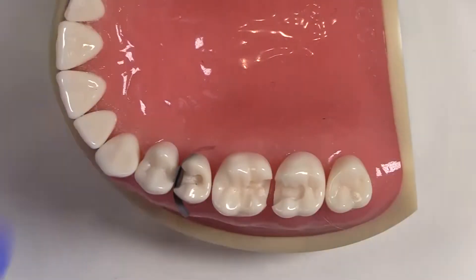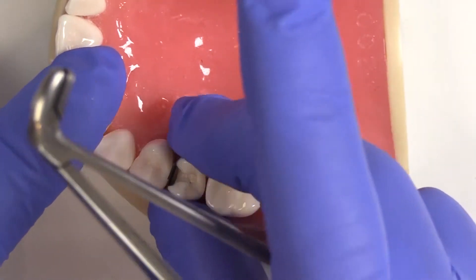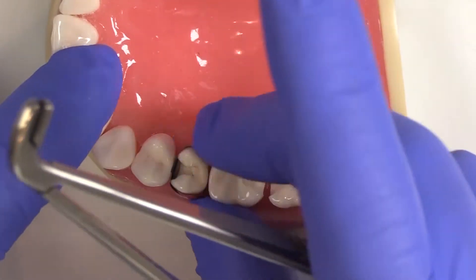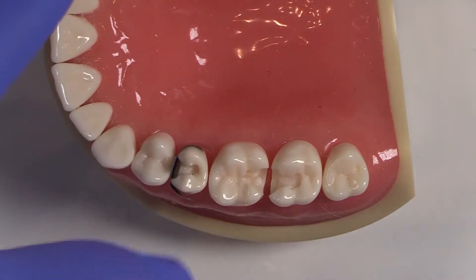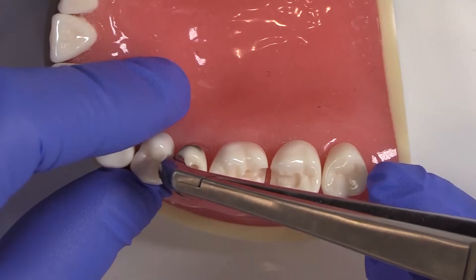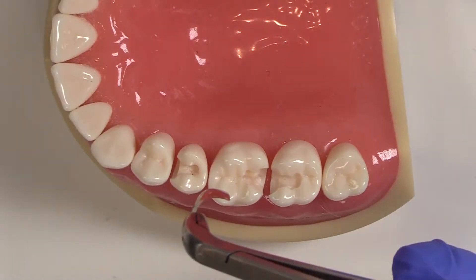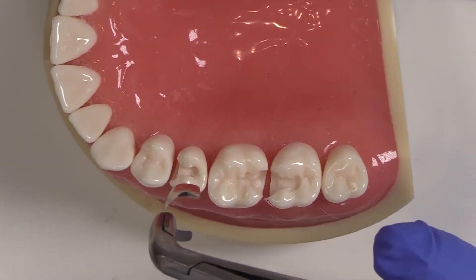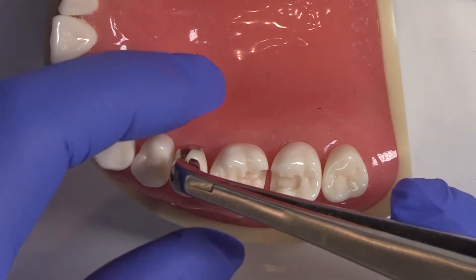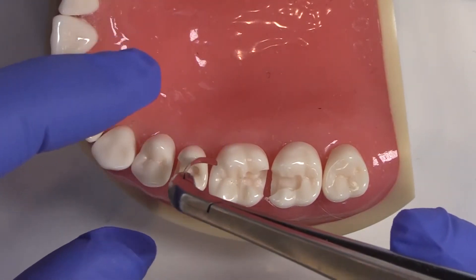What I like to do before I place it in is either pre-bend it or place it on the tooth and give it a little bit of contour to begin with. Then as I come in to place it, I actually try to get it to go into the sulcus — not just interproximally, but also on the buccal and lingual. Sometimes I'll even trim a little bit away if it's too long, because the further we go, the harder it is to get that to go into the sulcus. But in this case, it should be fine.